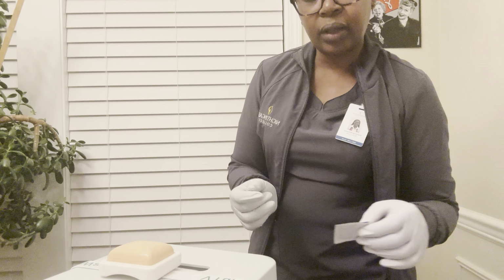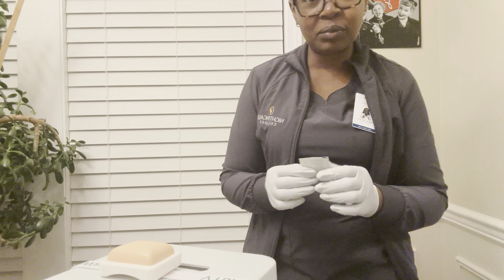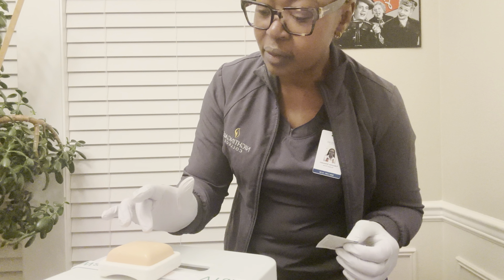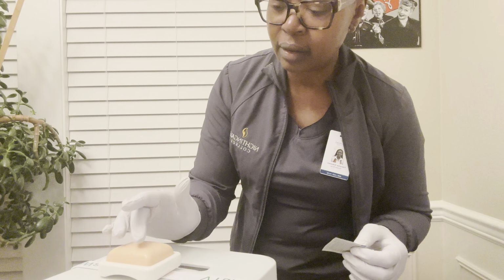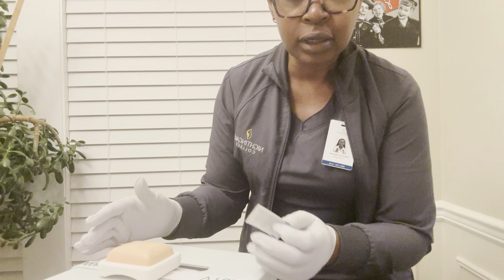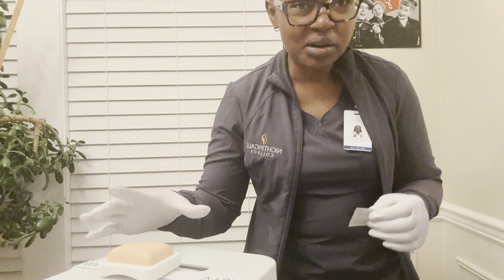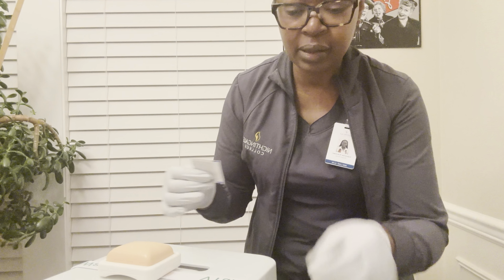My client wants the ventrogluteal area, and that's what I'm going to be cleaning. But before I clean, I want to inspect the area, assess for any mass or any damage on the skin. Make sure that the skin doesn't have any masses or any discoloration, and I have confirmed that. Then I'll go ahead and perform an anatomical landmark for where I will be injecting the medication.